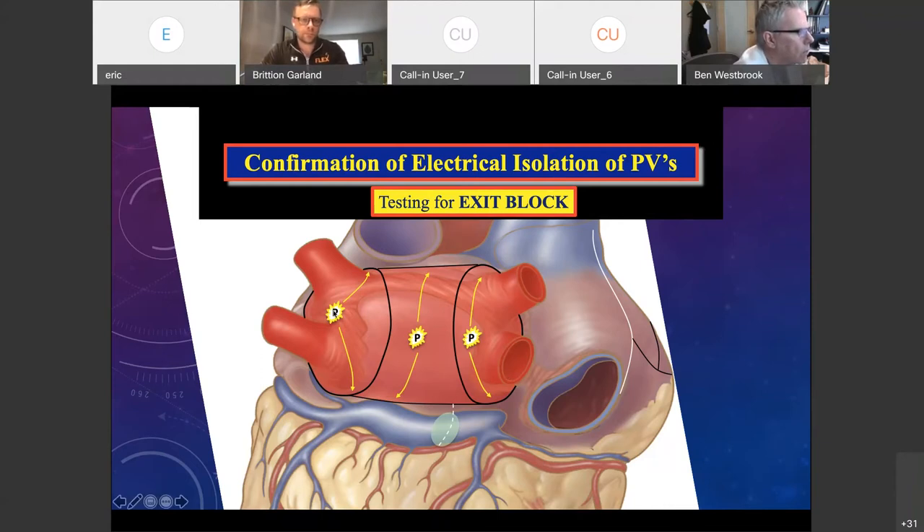I repeat the same process on the left side after left-side isolation. I'll do sensing and pacing at the same time — first I'll put the probe on and sense. No matter what rhythm the patient is in, you can sense and see if there are any atrial signals. If there are atrial signals, I'll re-ablate with eight burns. Almost never — unless the atrium is super thick or long — do I fail to get electrical isolation with entrance block and exit block on the veins with eight clamps.